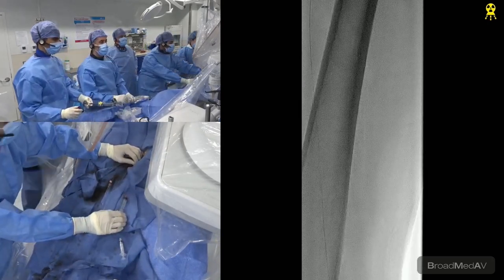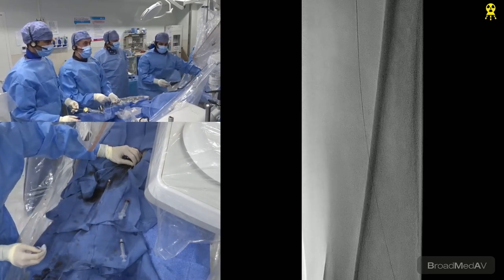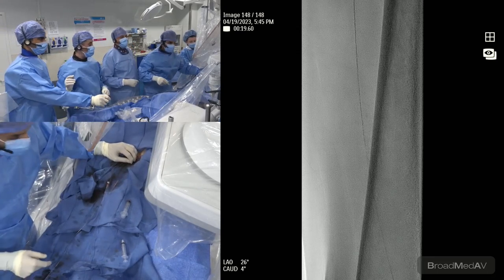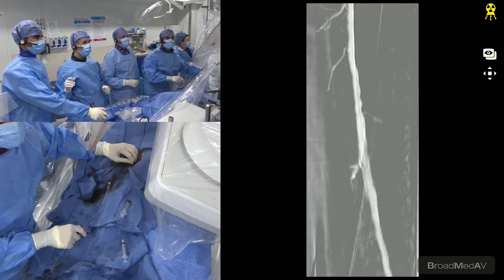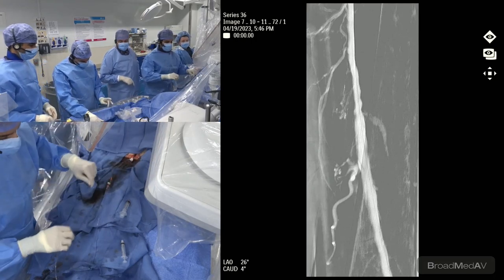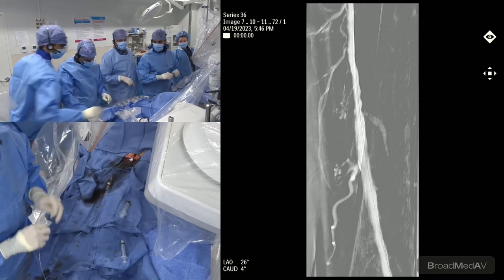Okay, stay still, my friend. Everything's going good. Maybe we ruptured, who knows? Roadmap. We'll see. Ready? Okay, a little more. Good. Roadmap. Pain in the groin, in your hand. Ready? Don't move. Oh, looks beautiful. Okay, one second. Off roadmap. We do it again. Let's do a regular DSA.